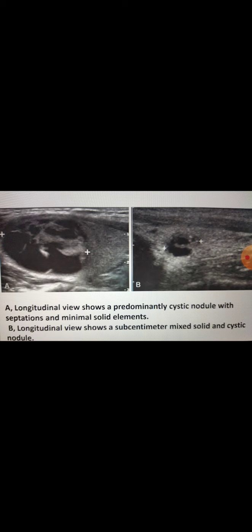So the role of sonography in this cancer is basically the metastatic spread that can alter the surgical approach. It is recommended that the patient should undergo sonography 6 to 12 months post-operatively, and then periodically based on the risk factors.